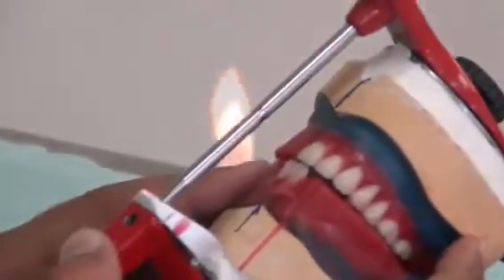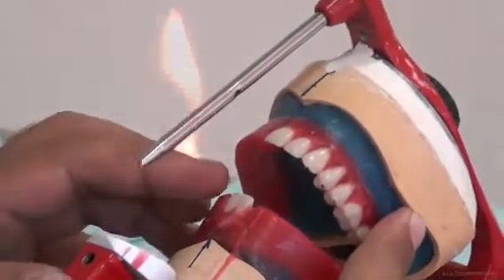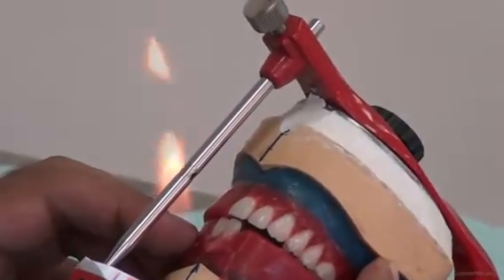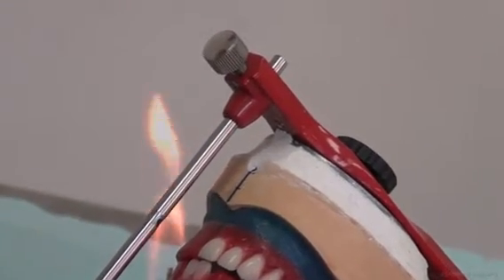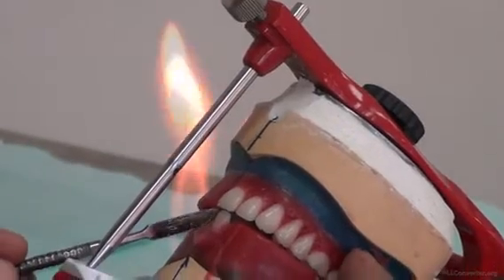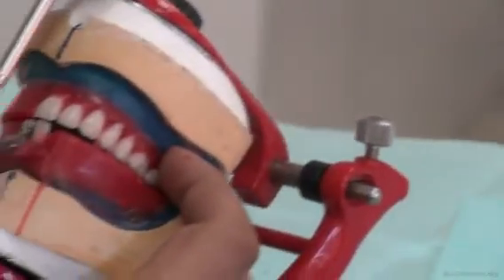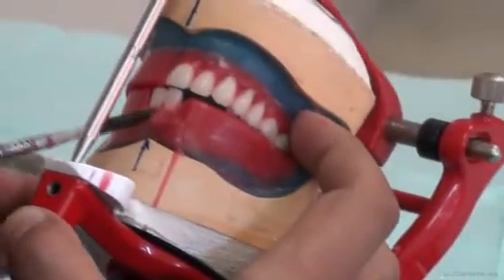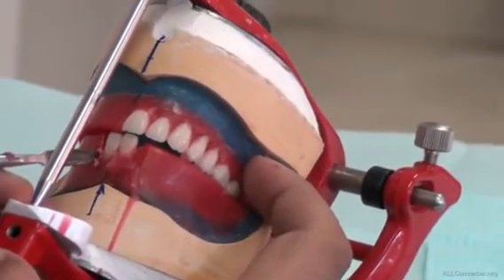So we compare it with the upper, overjet and overbite. This tooth, we cannot compare because we have the wax in, but if the tooth was there, we should have an overbite with the upper tooth. Okay, what we need to concentrate on is the midline. So what we are looking at is that the midline between both incisors corresponds with the midline of the cast to cast area.